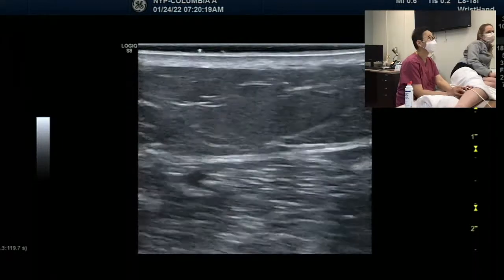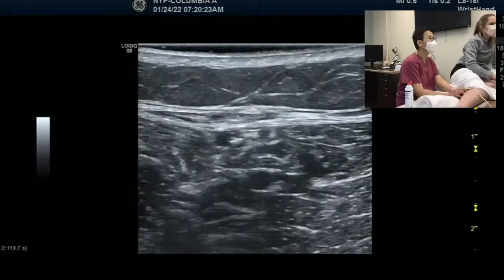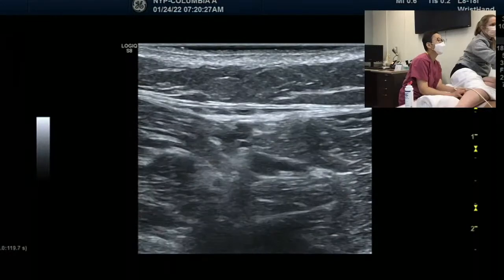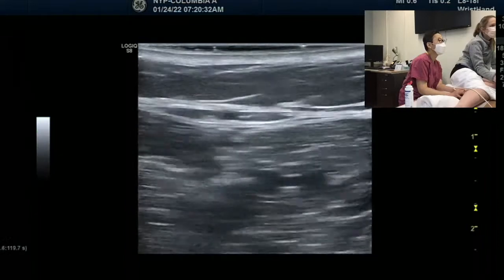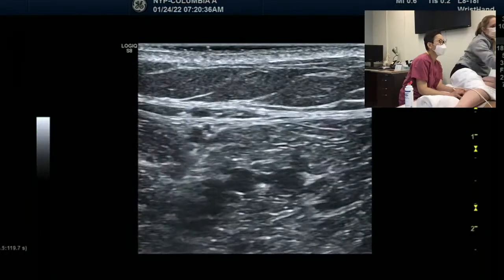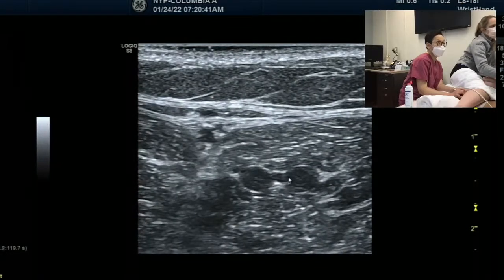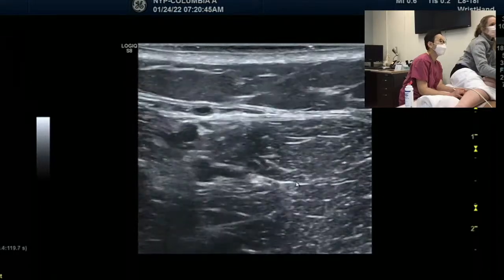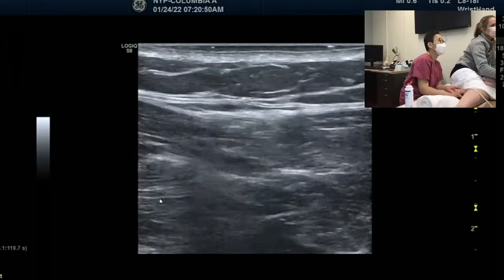So here, we have to look for the artery. Here, looks like it's alternate colorful. Now it's merging here. Here, look at it. I see two arteries, right? Can you use this cursor so they can see it? That's the posterior tibial artery. That's the fibular artery. If I go up, they merge and become the popliteal artery. Next to the popliteal artery, you guys see the tibial nerve.